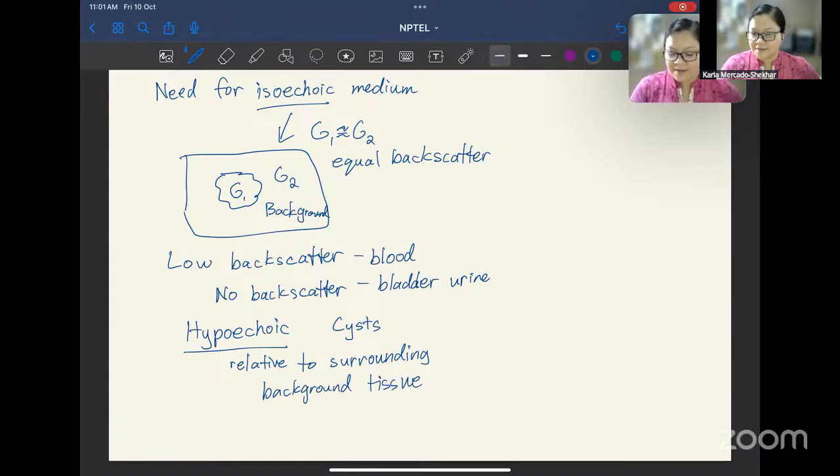So you have hypoechoic, we have isoechoic, and then we have the other extreme, which is hyperechoic. If you have structures with interfaces that have a large acoustic impedance mismatch, then you can get a really bright echo relative to the background at the interface. Like bone, for instance, or a buildup of fibrous proteins. So tumors can sometimes appear hyperechoic.